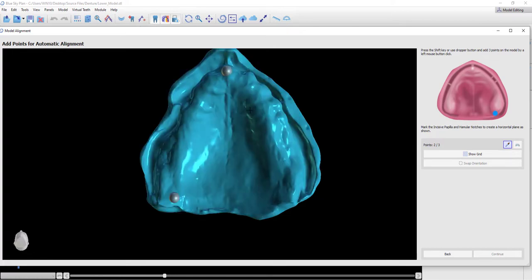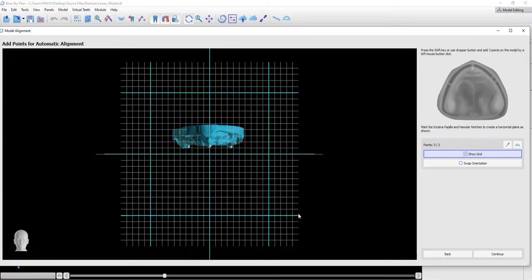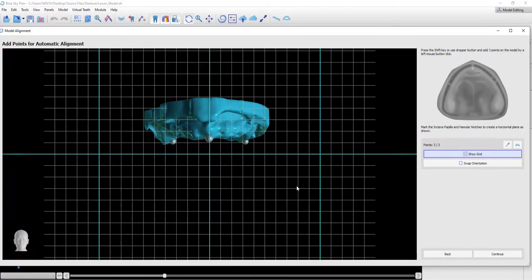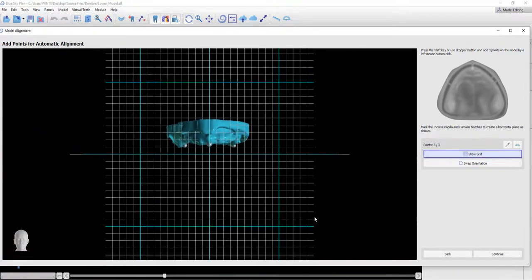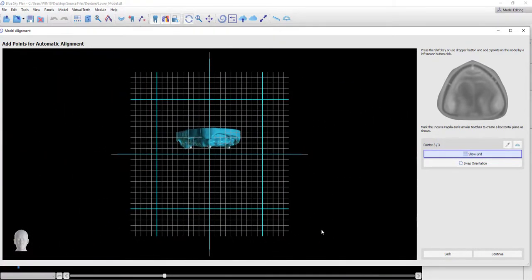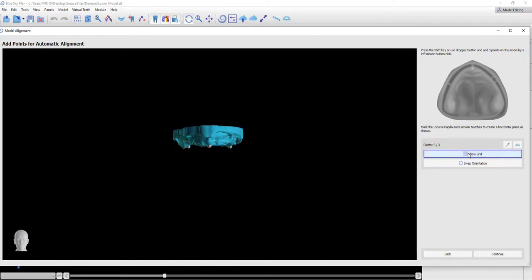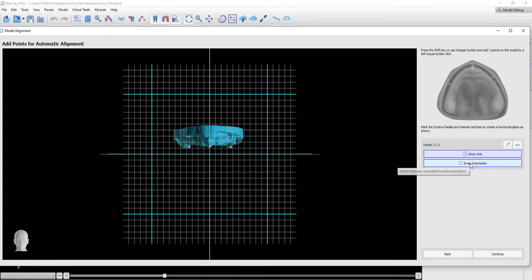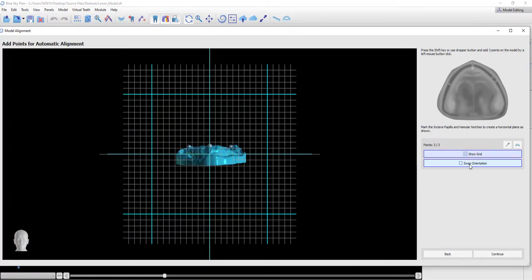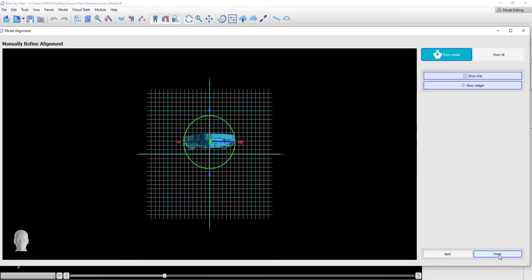We are marking the dots simply by holding down the Shift key and left-clicking. As soon as three dots are marked, the software automatically orients the model properly in space. We have the option of showing or hiding the grid. And if we wanted to invert the model, we can simply click Swap Orientation. Continue.